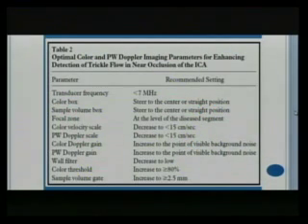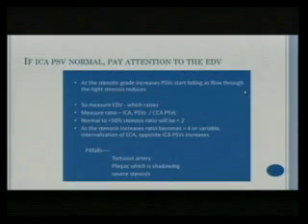I have discussed each of these parameters in my earlier lecture, and I assume all of you are familiar with it. If you're not, I can take this lecture again, but I have gone through all these 10 parameters, what they mean, and how they are under our control, and pretty much done the ultrasound knobology with all of you to understand how we can adjust these parameters to enhance finding just a trickle of flow as opposed to no flow.